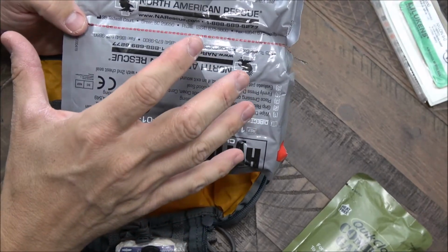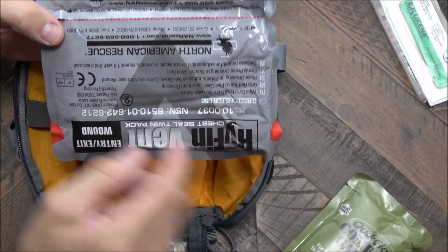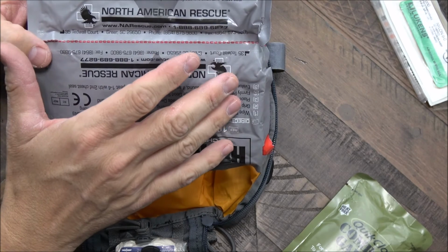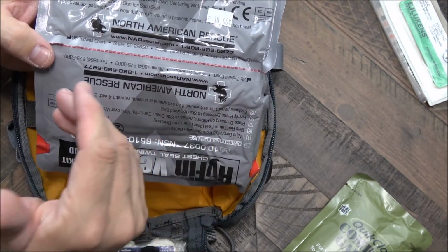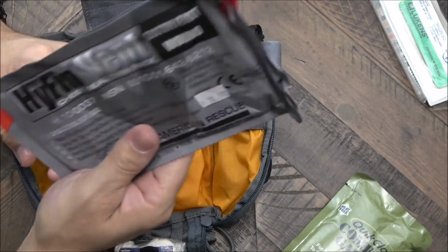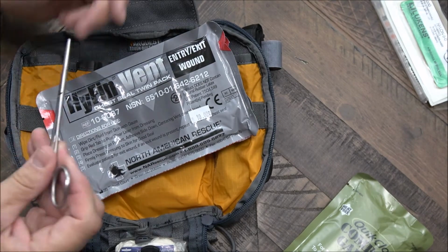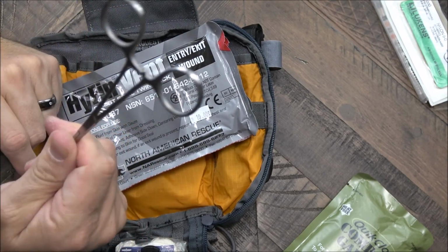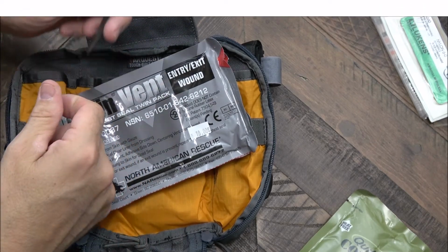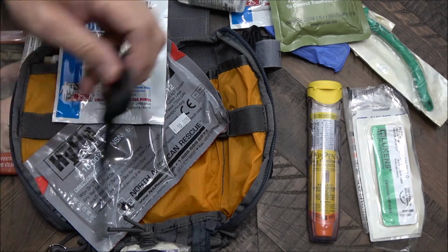Most of the chest seals that are out there generally come in a much larger kit, and they're almost the size of one of these. So you really want to, because sometimes with gunshots you are going to get an entry and an exit wound, and so you want to be able to seal both ends. Okay, so just something to keep in mind. And then of course I also keep a clamp in case I need to actually clamp a vessel or an artery.